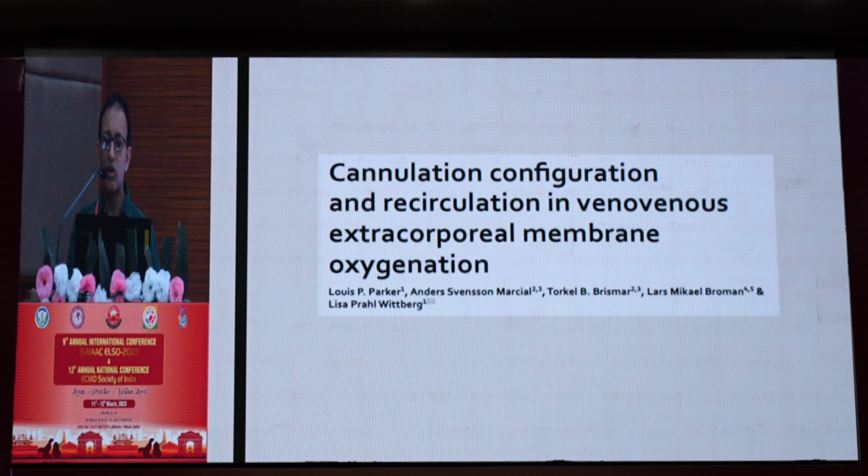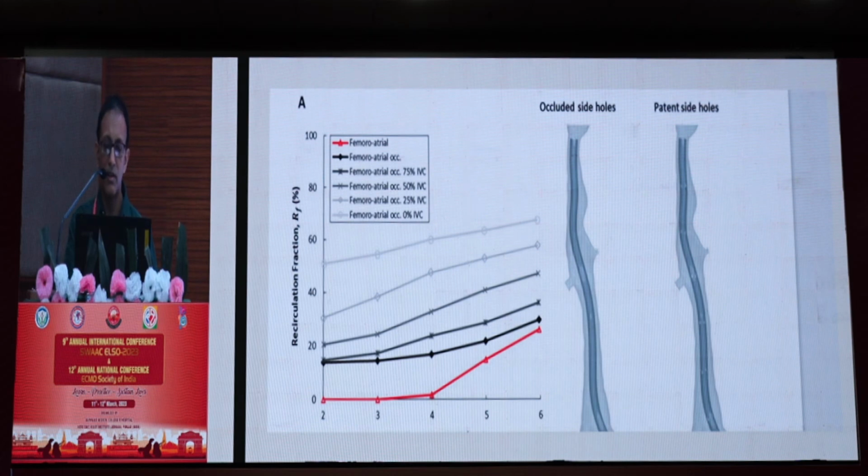These are computational fluid dynamics studies by Louis Parker et al. And they actually showed different methods of how recirculation can increase in different scenarios.